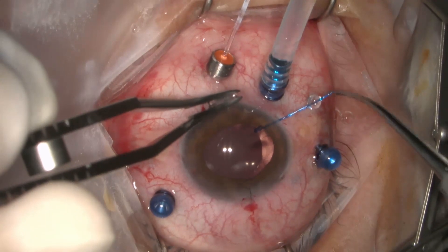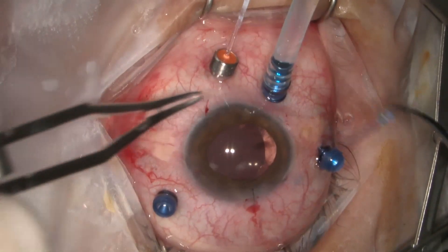The primary break is endocoagulated. Beware with this cautery probe to avoid touching the underlying retinal pigment epithelium.